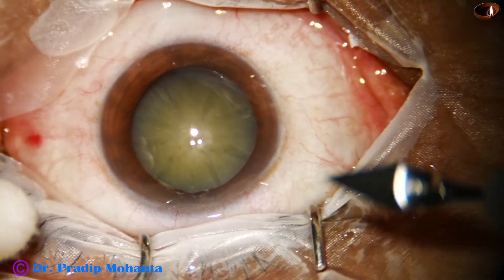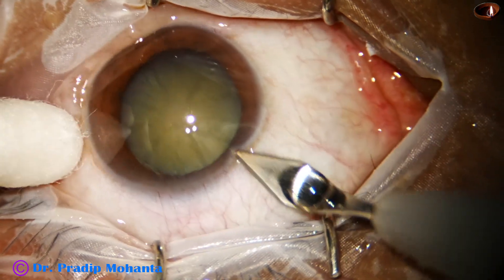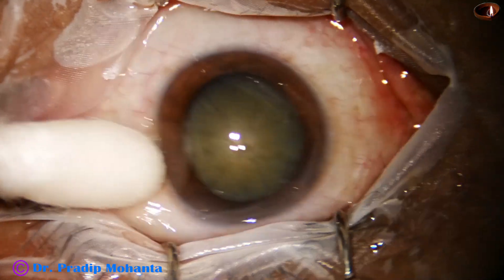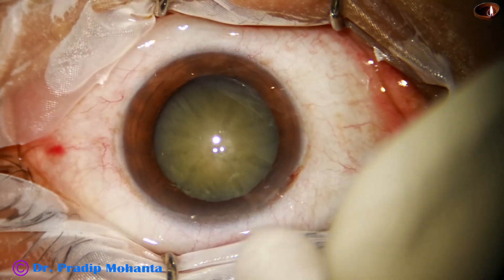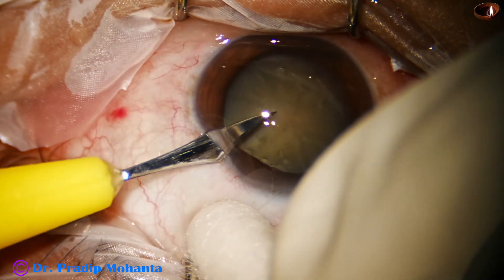This is a white cataract, a totally mature cataract. This is the main incision with a 2.8 millimeter steel keratome at around 11 o'clock, and now a side port is made three clock hours away from the main incision on the left side.